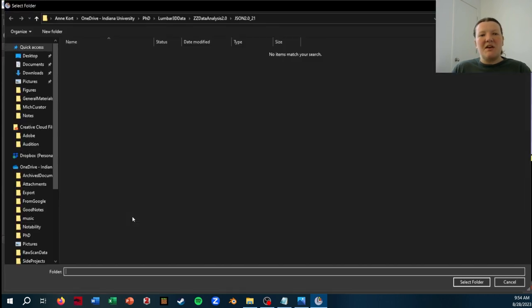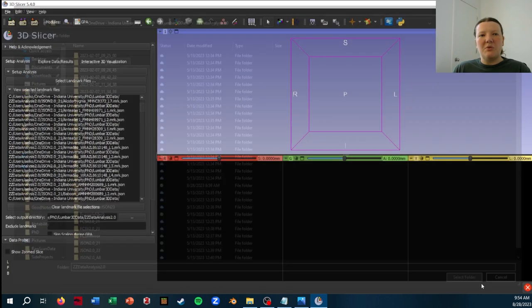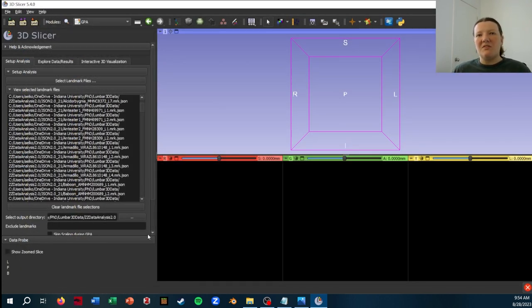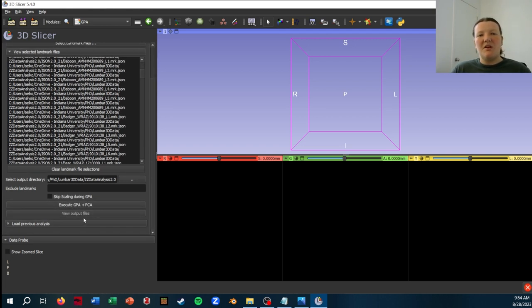I'll also want to set an output directory, which I've just been using the same folder. And that is where your PCA and Procrustes coordinates are going to get exported in a nice format that can be used in other software.